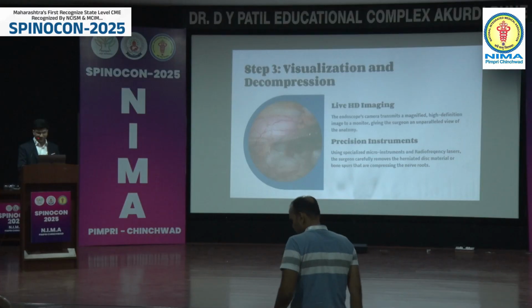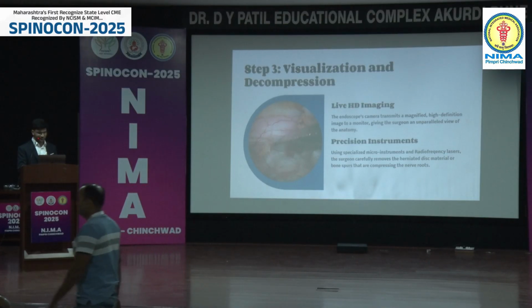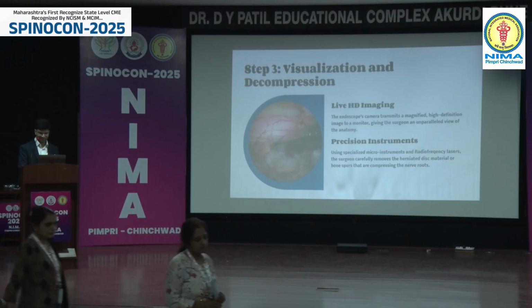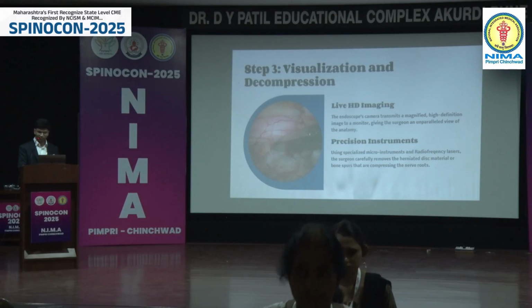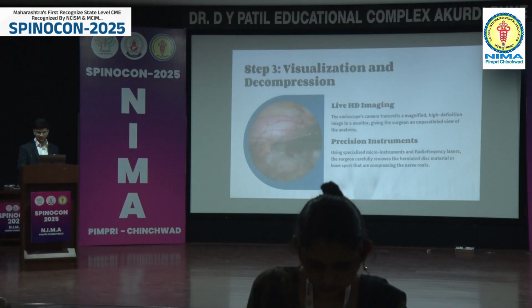The endoscope camera transmits a magnified high-definition image to the monitor, giving the surgeon an unparalleled view of the anatomy. Using specialized micro-instruments and radio-frequency lasers, the surgeon carefully removes the herniated disc material or bone spur that is compressing on the nerve root.